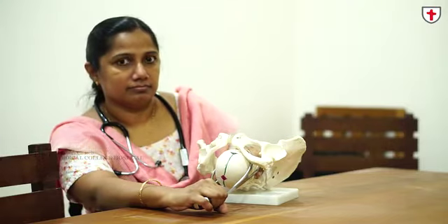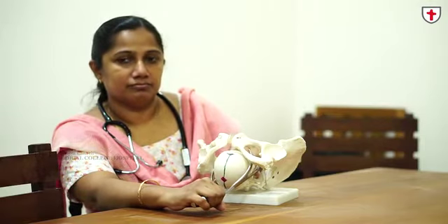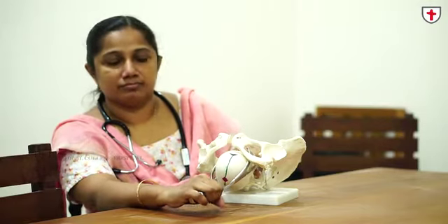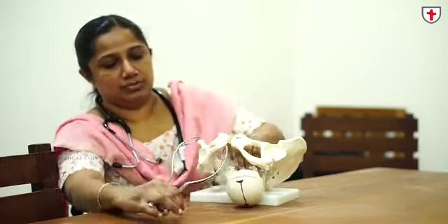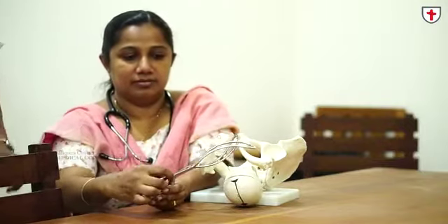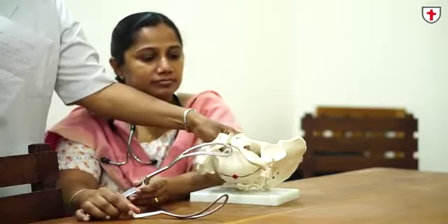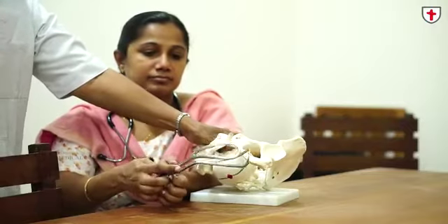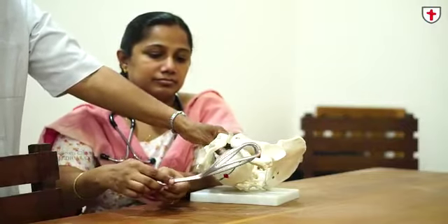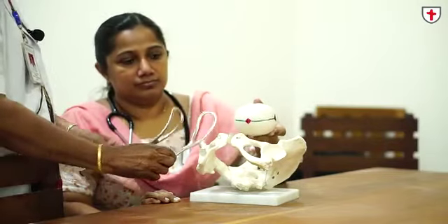We have other forceps as well. Unfortunately, our department doesn't have the rotational forceps. The rotational forceps is the Kjelland's forceps. Here, you have an anterior and a posterior blade rather than a right and a left blade. We will show you how to apply this with the outlet model. Whenever there is a deep transverse arrest, we will show how you apply an anterior and posterior blade in Kjelland's forceps.